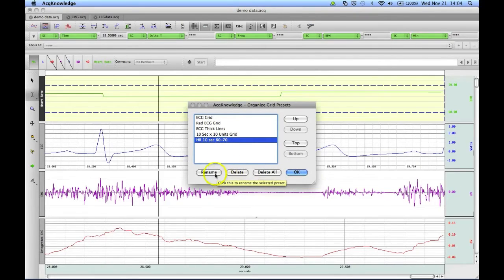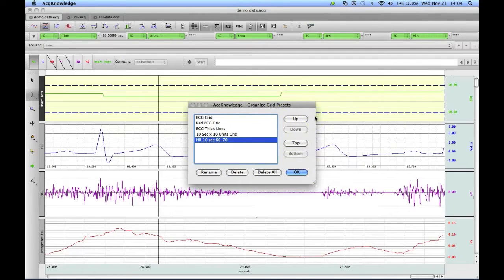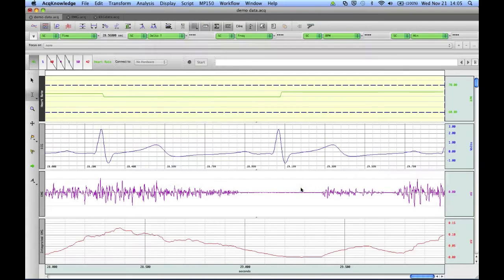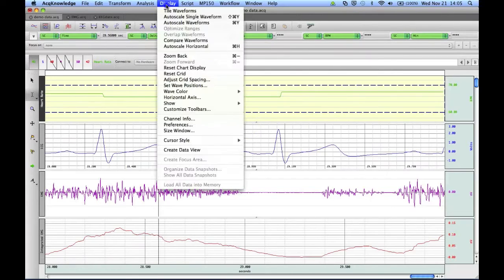You can also rename it, and change the order of your presets and how they appear in the list. Once you've made your changes, you can click OK.